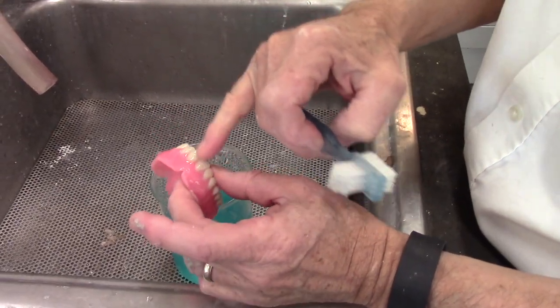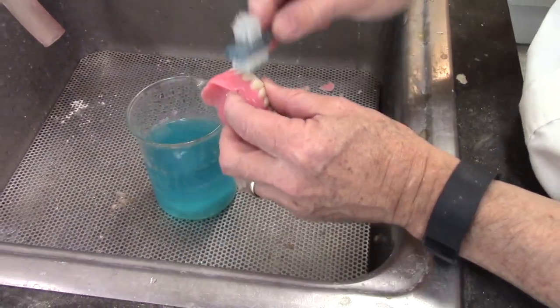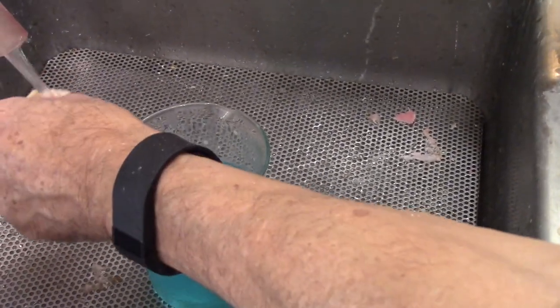Any polish stuck in between the teeth needs to be cleaned off. I just use a denture brush and ultrasonic all-purpose cleaner to remove any residual green polish.